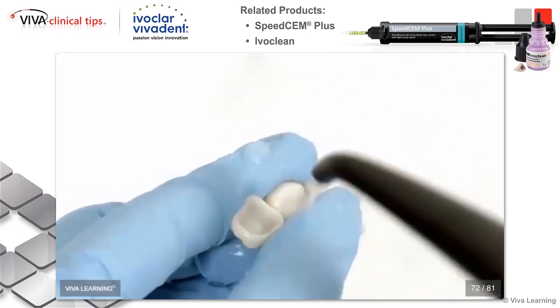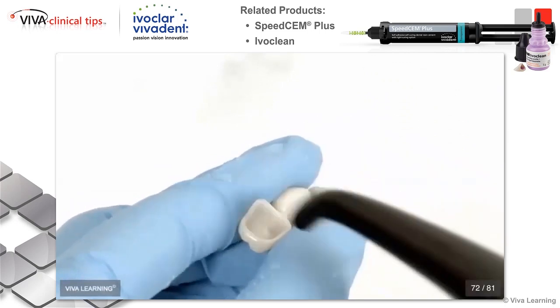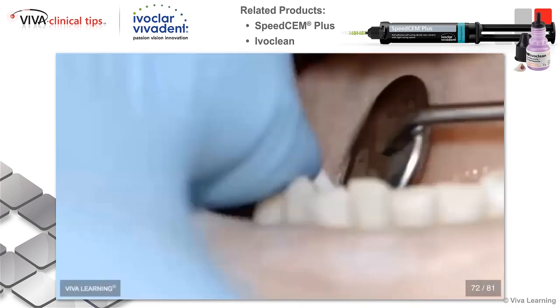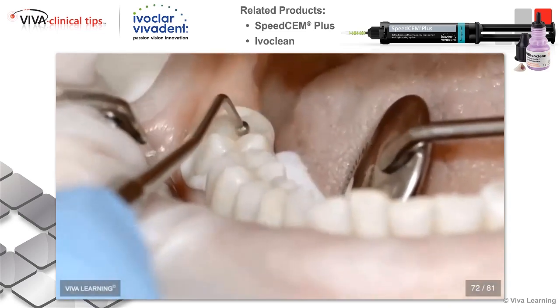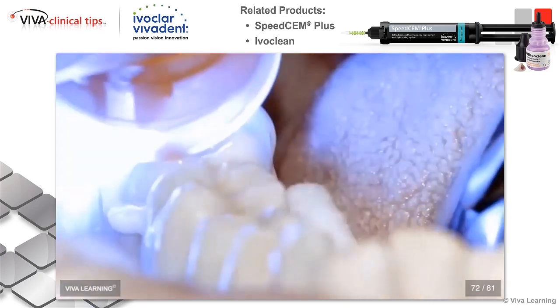So after you rinse it out, make sure that you dry it as well afterwards, because the next step is to place the SpeedCEM Plus cement directly into the bridge. And you can see how easy it is to express it right from the syringe into the bridge, and then we place the bridge into the patient's mouth. And again, we'll use a ball burnisher to push down on the bridge and verify that it's completely seated before we do our spot tack.